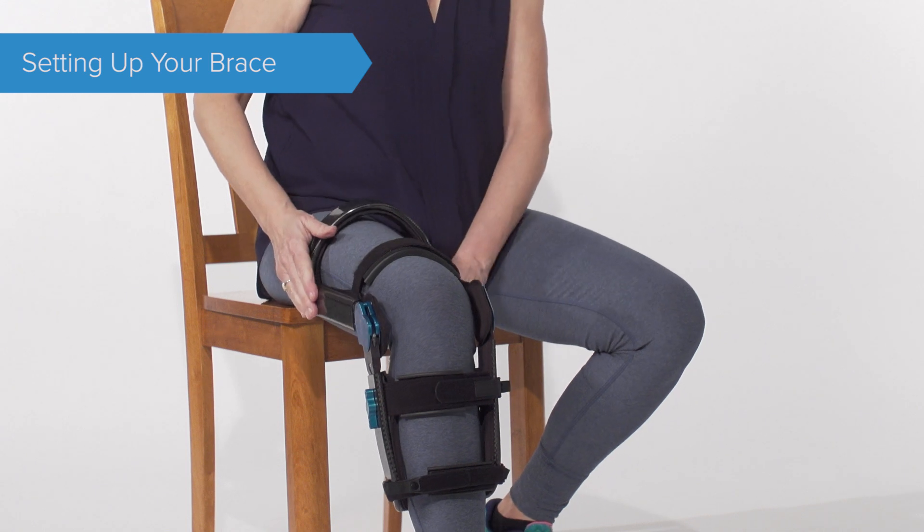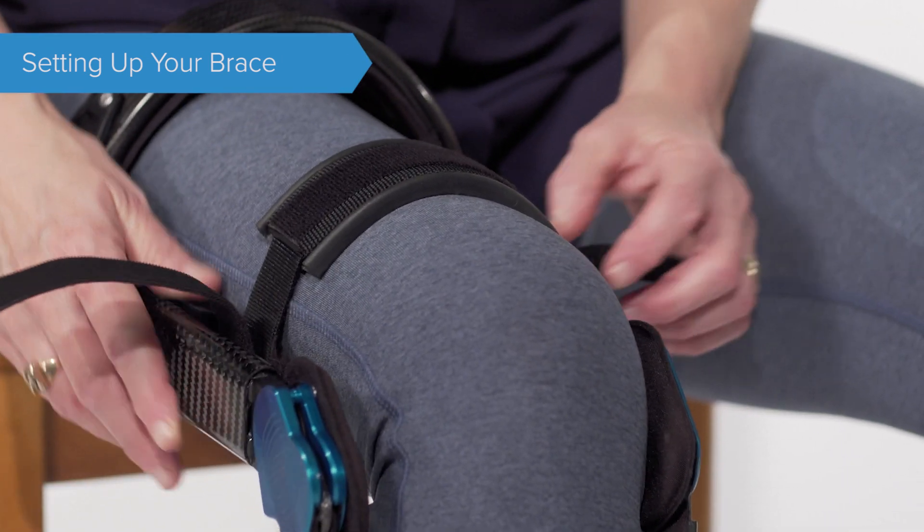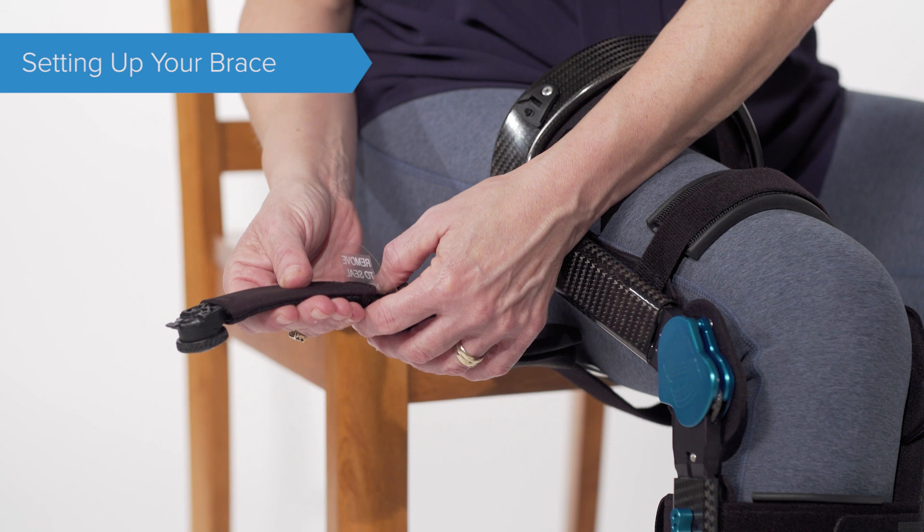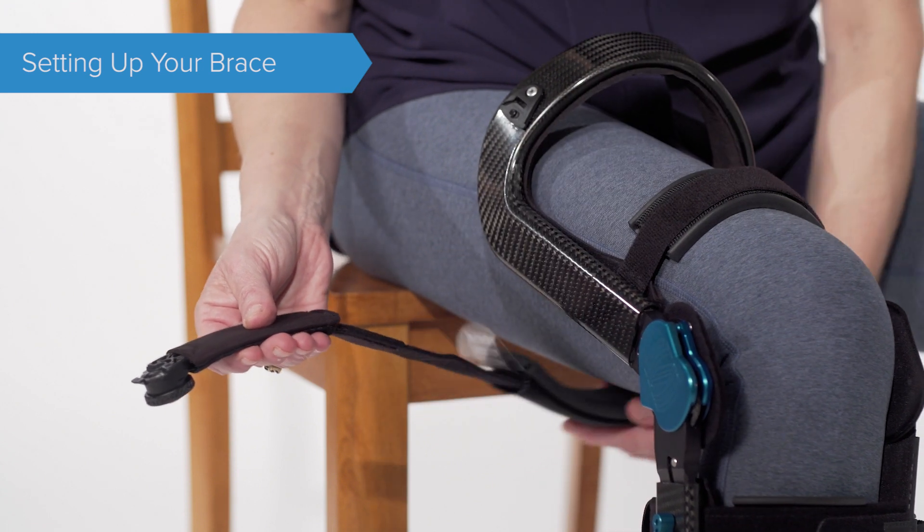Quick tip: over-tightening this strap will cause the brace to sit too far forward on your knee. Ensure the tensioning knob is pulled out and tug on the strap fully to lengthen.